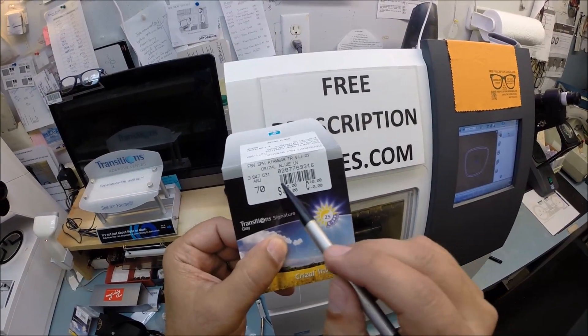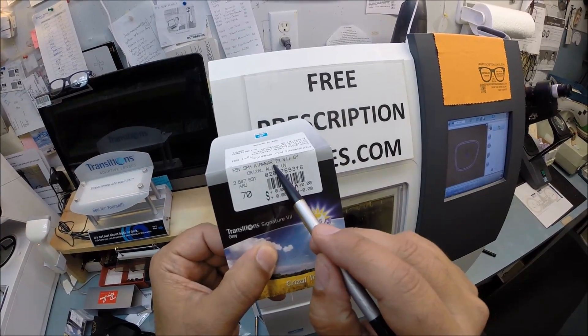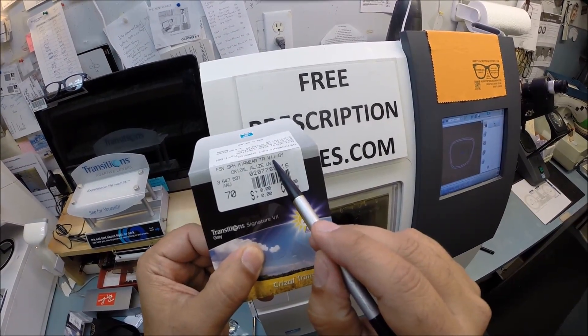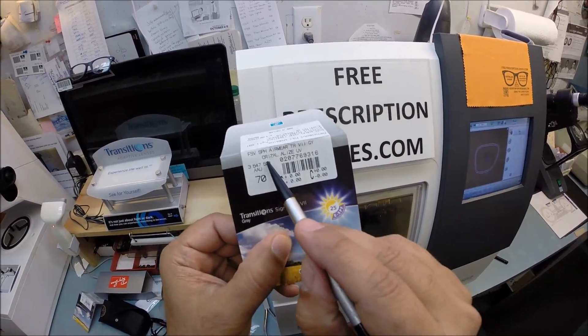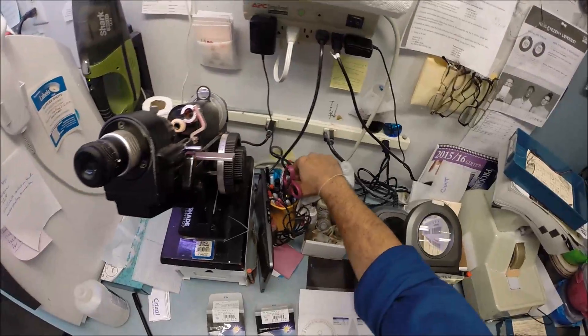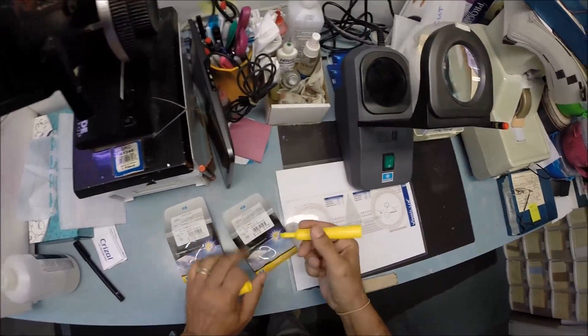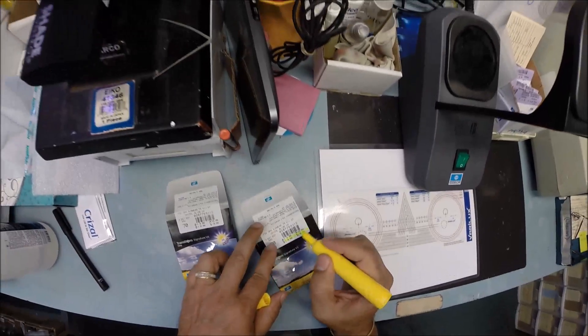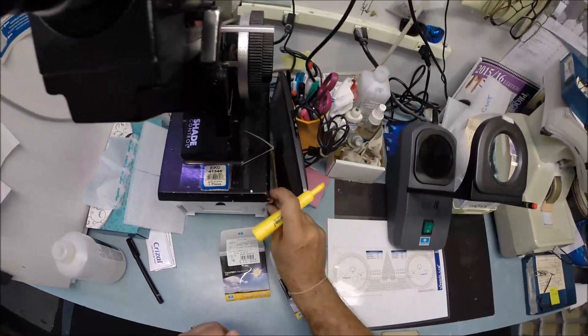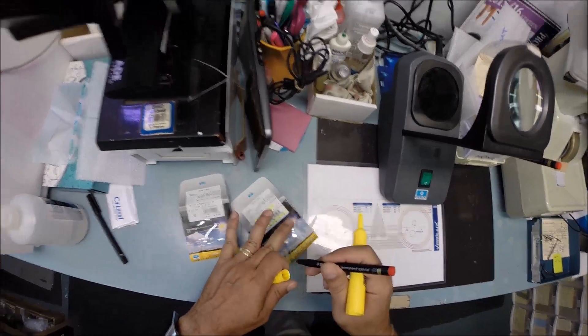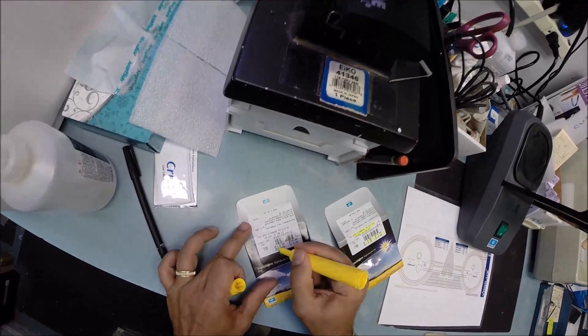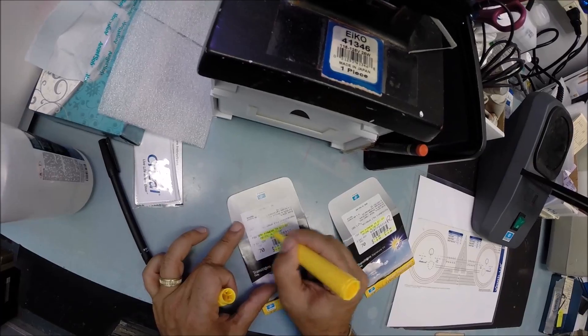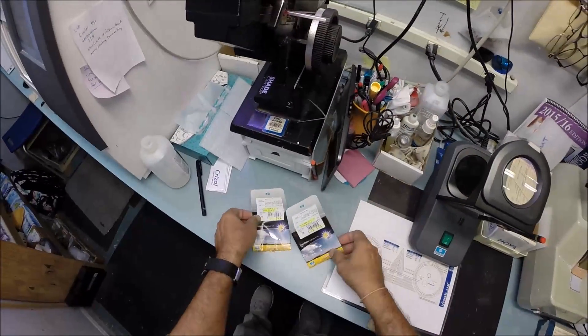Essilor calls polycarbonate Airwear because they feel they're as light as air. TR stands for transitions. The Roman numerals for seven. GY stands for gray. Transition Signature 7 gray lenses with Crizal Alize. Let me go ahead and highlight these. These are non-prescription. Zero-zero. Transitions with Crizal Alize.